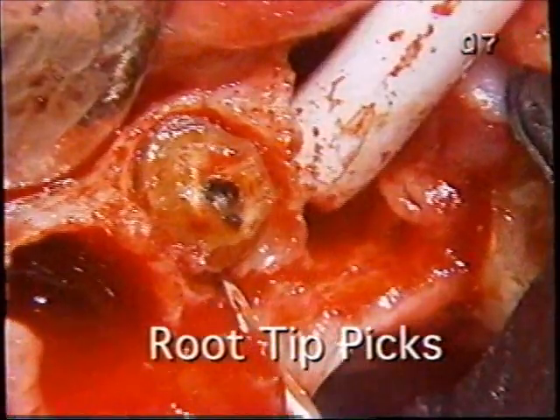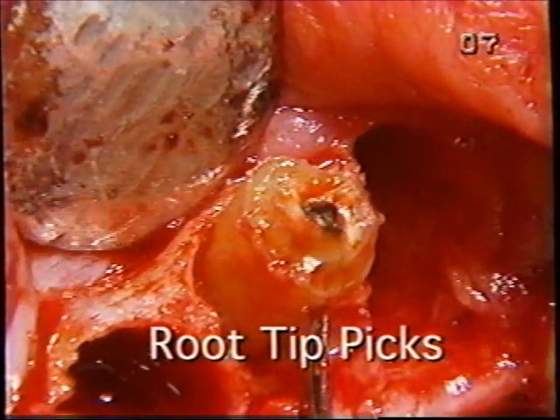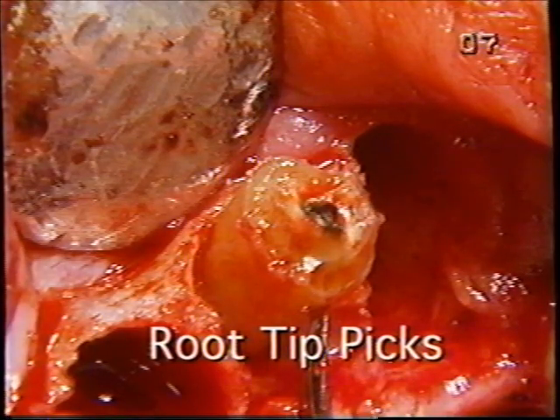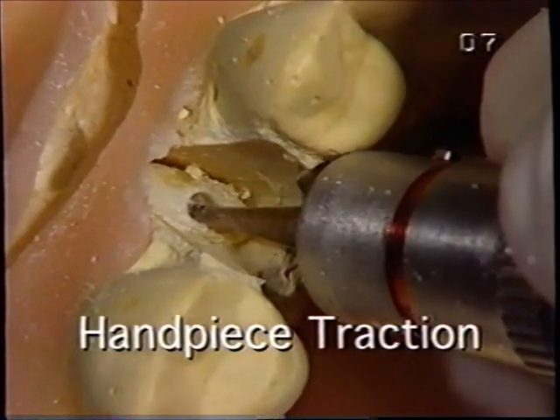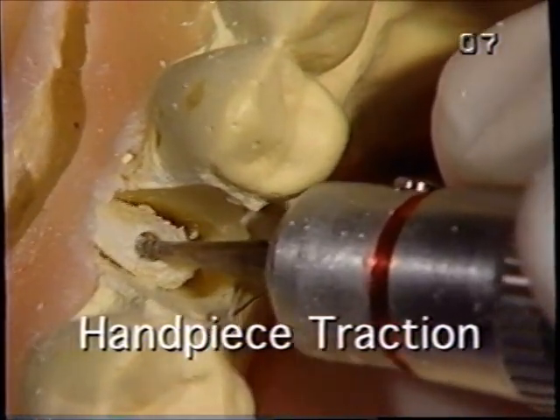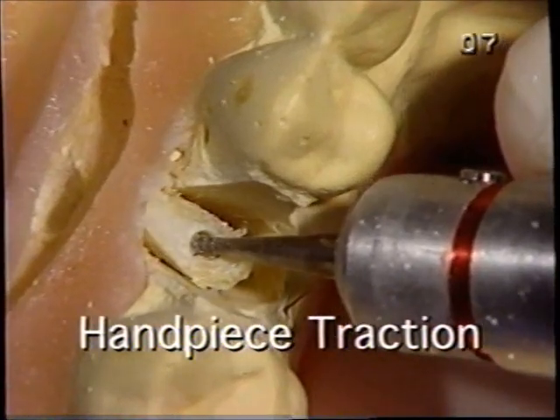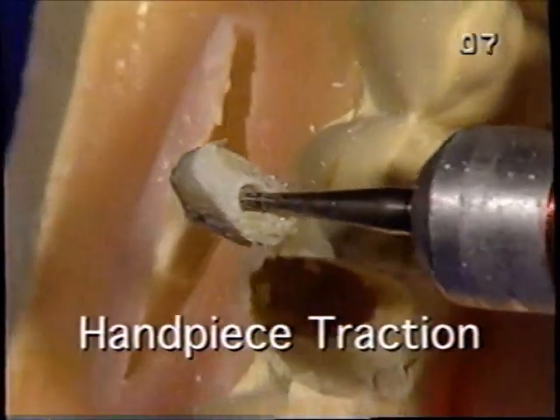Root tip picks. When I say root tip picks, we need small and large for small roots, and then a different set for large ones. Straight handpiece traction, where a straight handpiece with a number 6 round burr goes into a root that you have access to and is stalled, using that with traction to remove the root.